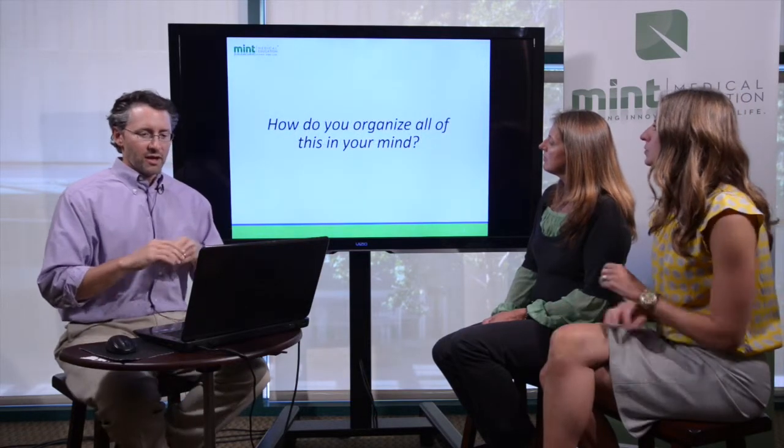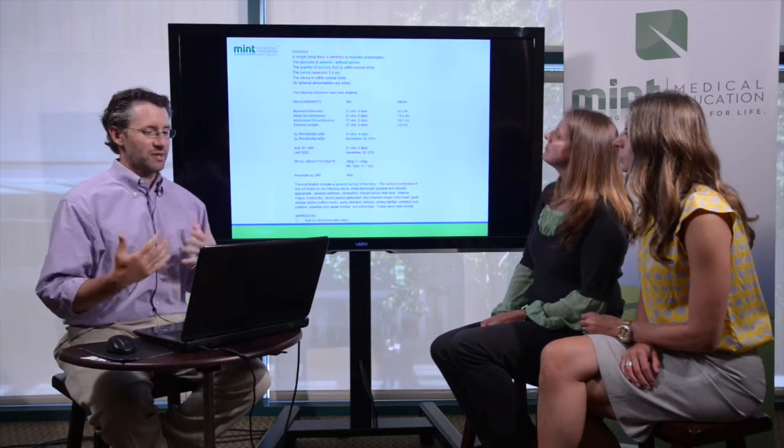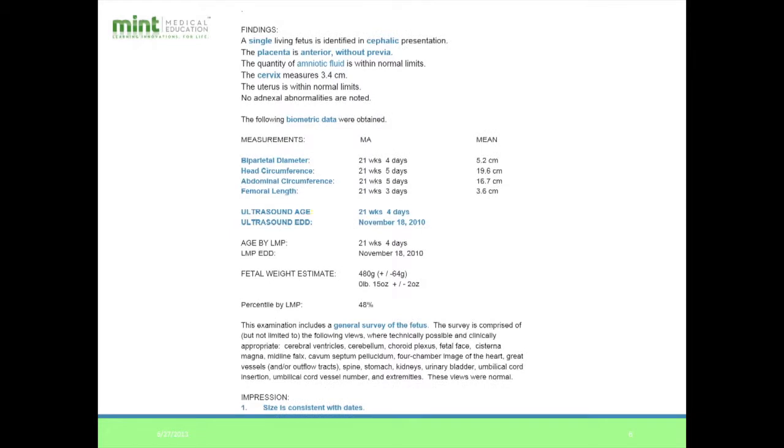So with all that said and all the anatomy in the baby, how do you organize all of this information in your mind? And this is by no means meant to be something to look at and read all over, but this is a standard report that we use for a second trimester scan. And it tells you everything you need to know.